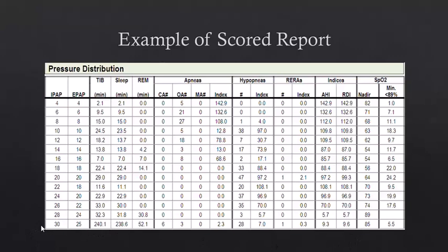But once the patient got up to here, it would have been nice to see, having left him there for about a half hour, and then backed him down, do a down titration, 29 over 20 or 29 over 25, 28 over 24. Keep slowly backing it down and go back to the pressures that were skipped potentially. Because again, those could all be missed opportunities. Maybe we missed the patient's optimal pressure because that optimal pressure was skipped.